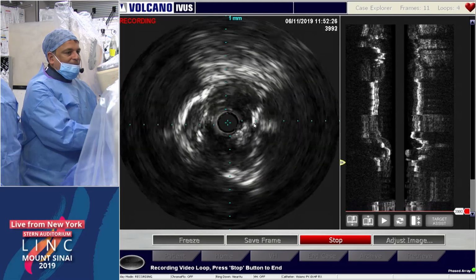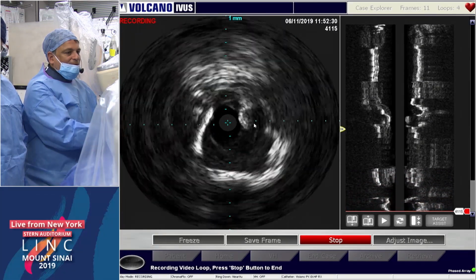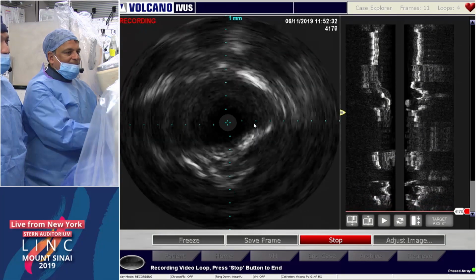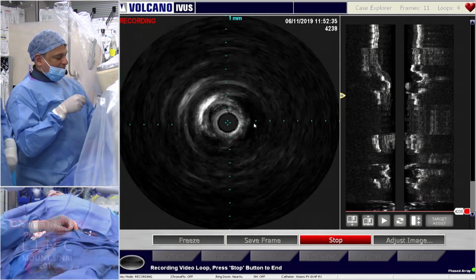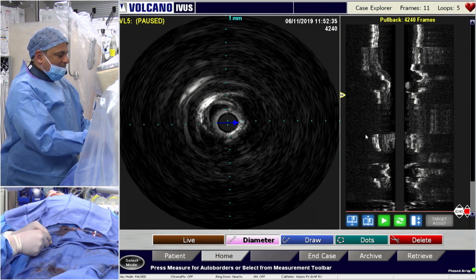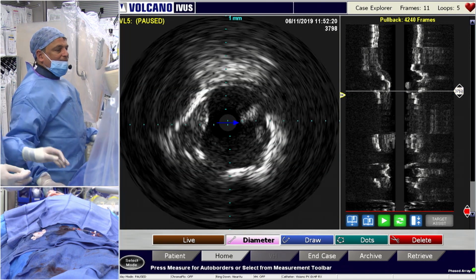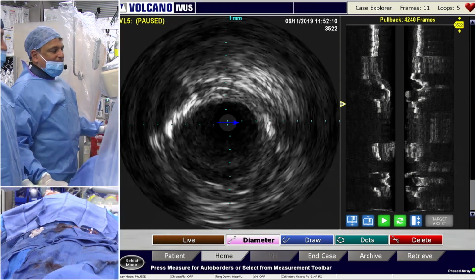So I don't know whether you guys would take care of this ostium. I don't know, because it's really a complex issue because the profunda is also involved in that area. I think I may just do a Stellarex of that proximal lesion above the stent that we saw, and then call it a day here because I've got good outflow.